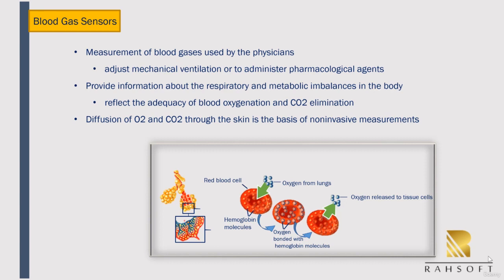The machine works by using the non-invasive measurements of the diffusion of oxygen and carbon dioxide through the skin, as shown below.